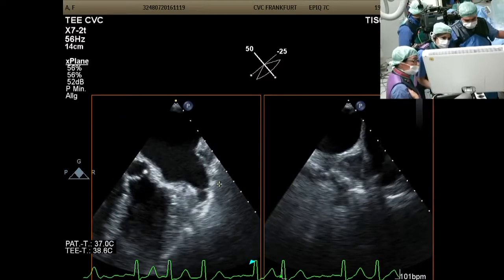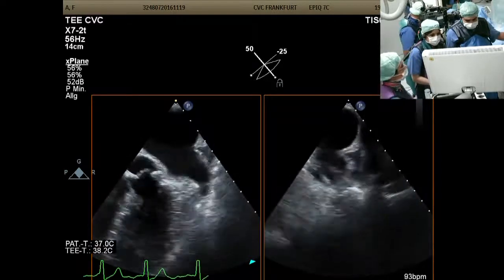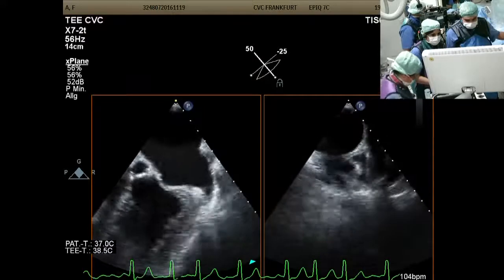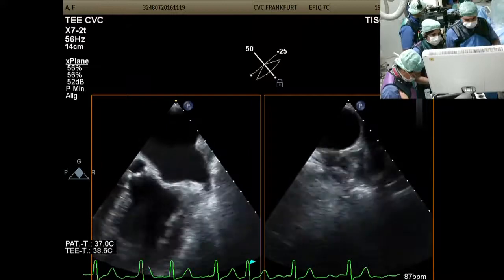So if we took the whole of the top of that orifice there, we're getting 25, and then we get at the level of 16. Notwithstanding it being relatively shallow, yeah, it looks otherwise amenable, doesn't it? Good question. We're still looking.